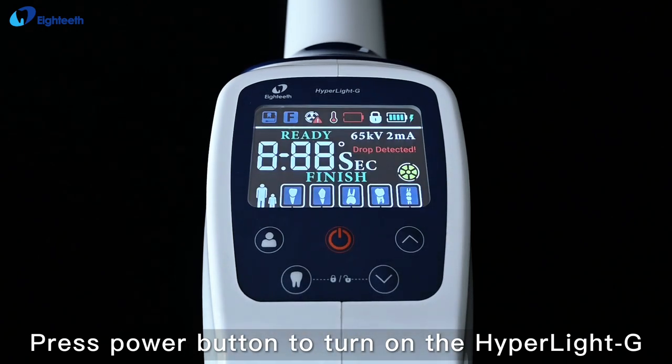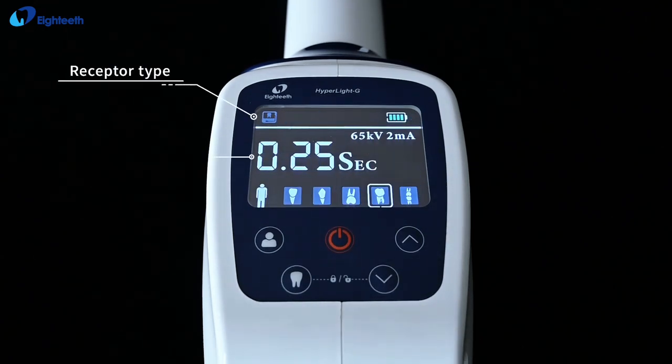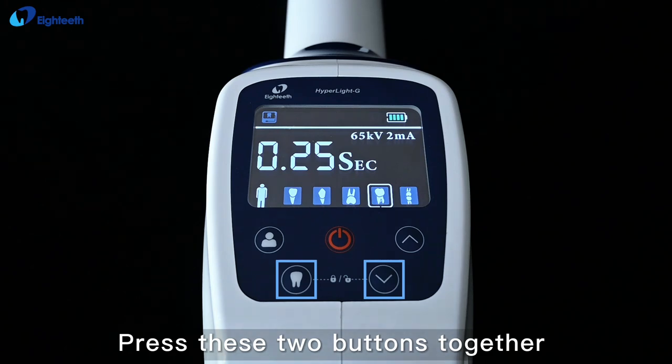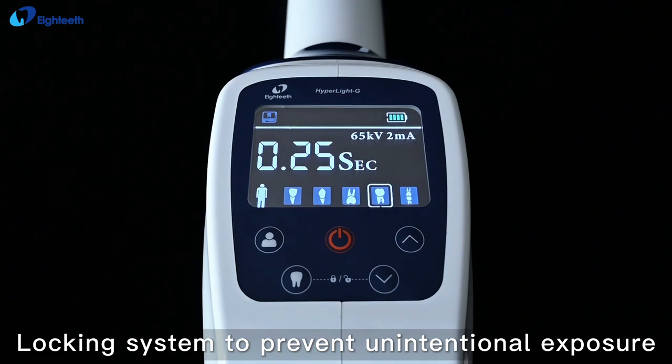Press the Power button to turn on the Hyperlite G, then enter the boot interface. Press these two buttons together to lock or unlock the machine. This locking system prevents unintentional exposure.